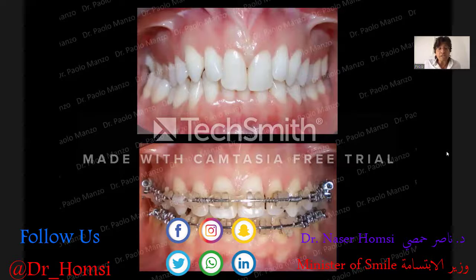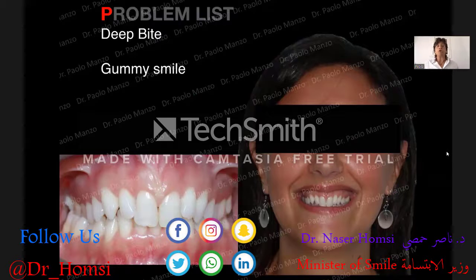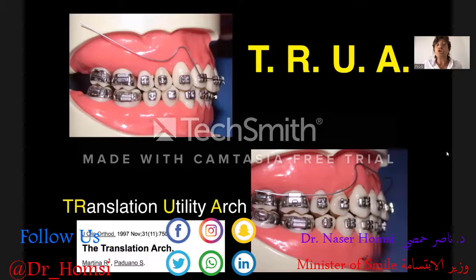Now, once the crossbite is corrected, we have to correct something more. It is the deep bite and the gummy smile also, because we can correct deep bite, and in the meanwhile, we can correct gummy smile. But after, we will check how it's possible to correct very efficiently gummy smile in a deep bite patient like Daniela. In this case, I was asking Daniela to use class 2 elastics, and we corrected the deep bite and also the torque of the upper incisor by means of this wire that is called TRUA.